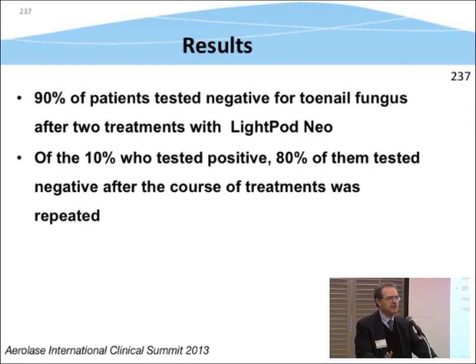There have been two patients where we've gone up to three times, and we have not had any situations where we have not been able to treat the fungal nails. But again, we're very tight on protocol. Even if I would bet my life that they have fungal nails, if I can't prove it on lab tests, we don't do it.